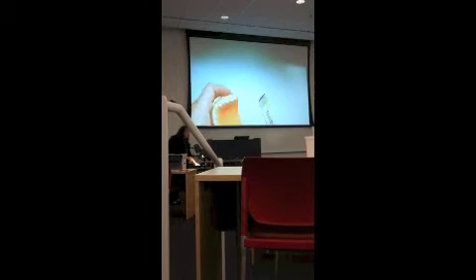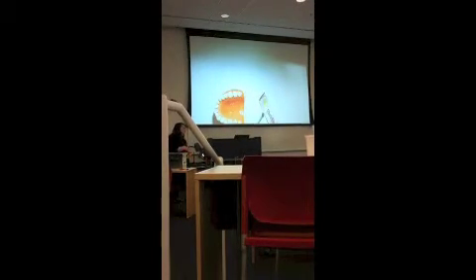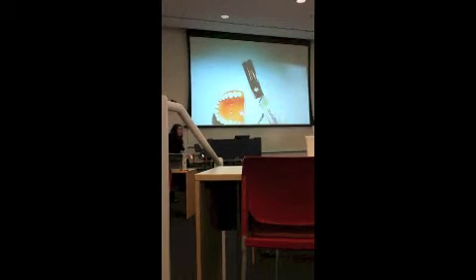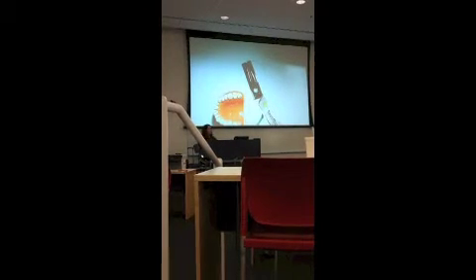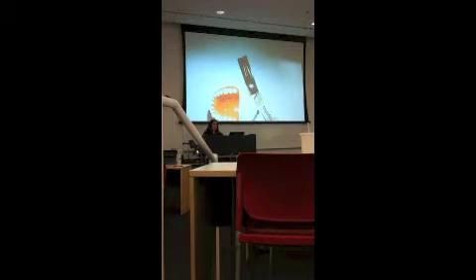Now, if the patient builds up excessive saliva, what you can do is, midway through the procedure, go ahead and have your assistant use the saliva ejector and just suction out the excess saliva. Okay, but you're going to work quickly, and the patient should be done in a few minutes.